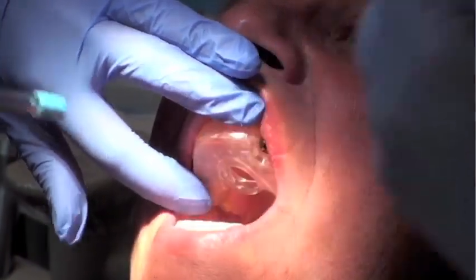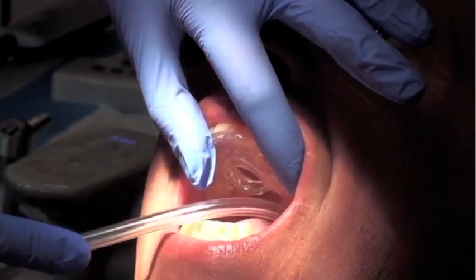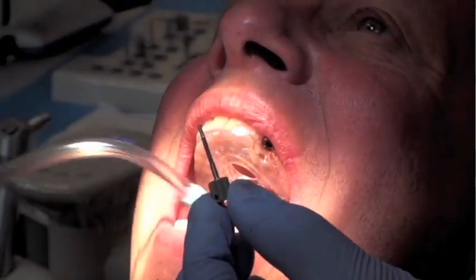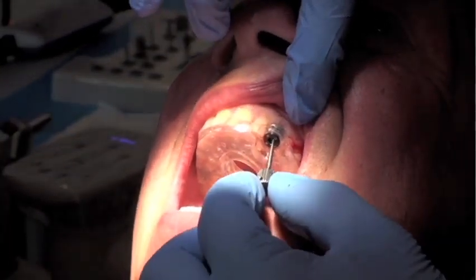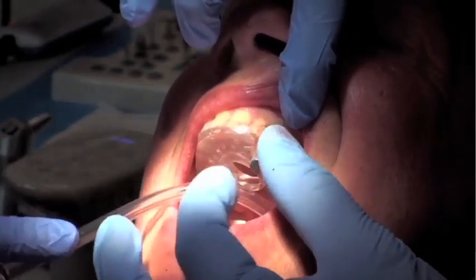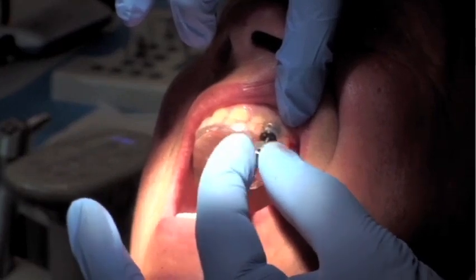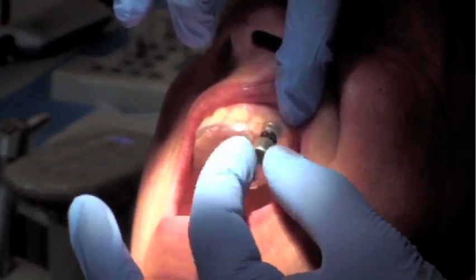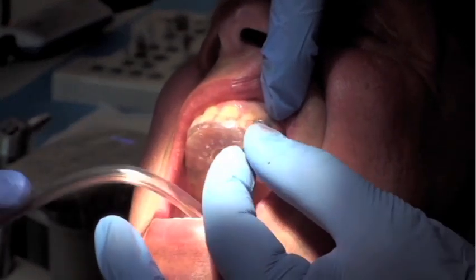Once the screw is removed, there's an implant holder removal tool — that's what you see here. This tool is threaded clockwise into the implant itself. In doing so, it releases the implant holder from the implant, which disengages the surgical guide from the whole complex. This allows us to safely remove the implant guide without dislodging or disrupting the implant that was just placed.